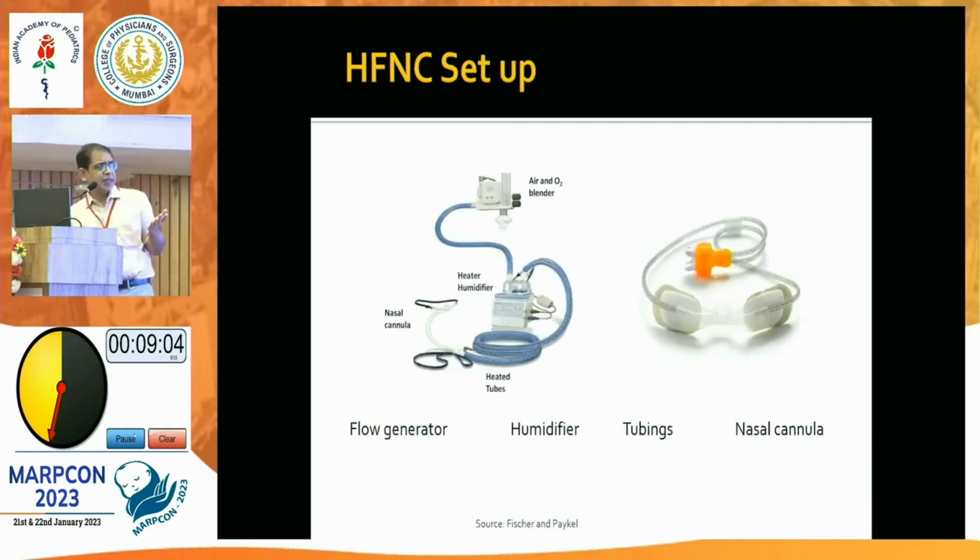This is the typical setup. There is a blended air which comes through the wall supply. There's a humidifier.